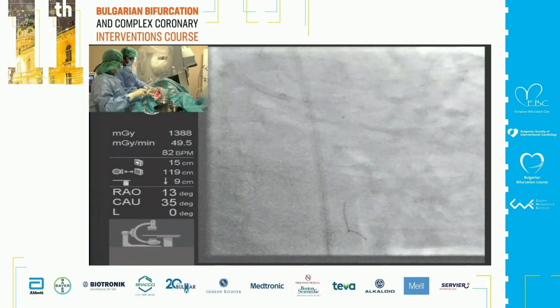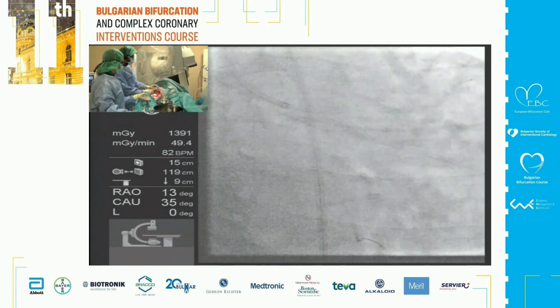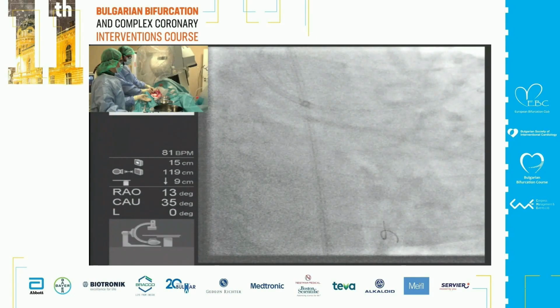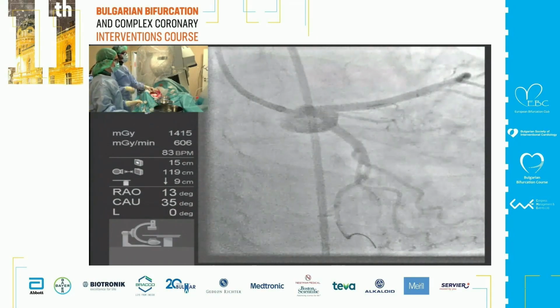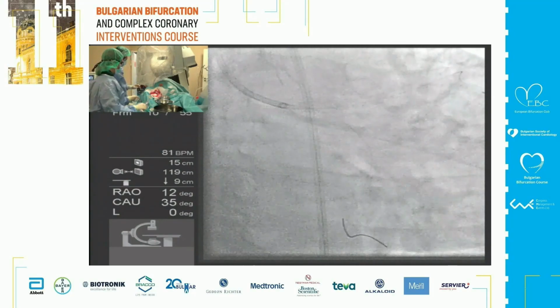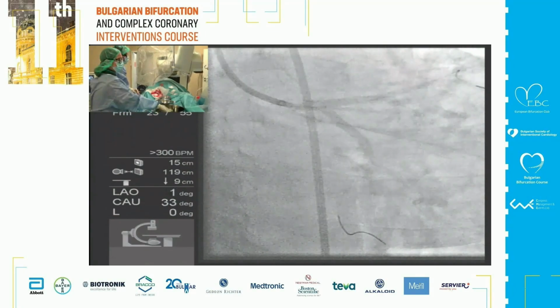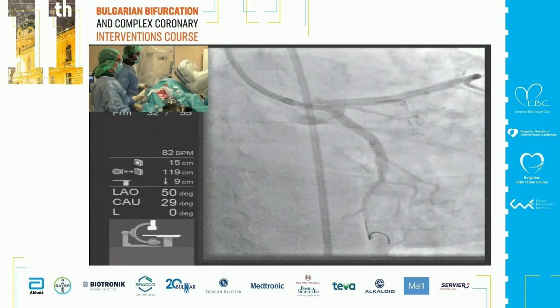But this is a kissing which will be followed by POT. No, I don't agree with you. If I do it this way, it is because I don't want to sum the two diameters in the proximal segment. I sum the two diameters in the polygon of confluence. So only 2 millimeters. Look at this result. And what are the pressures?